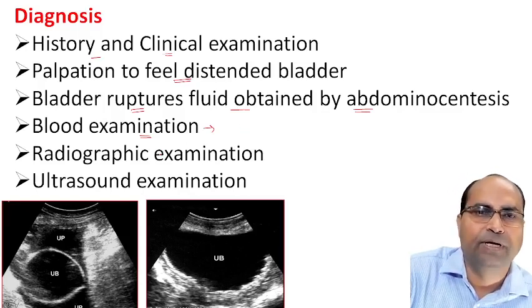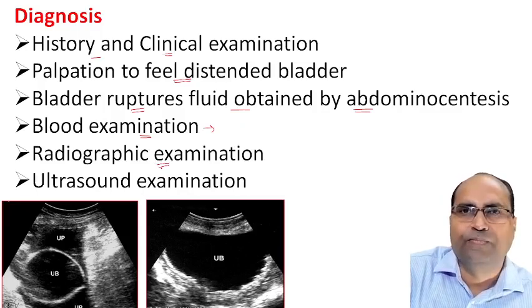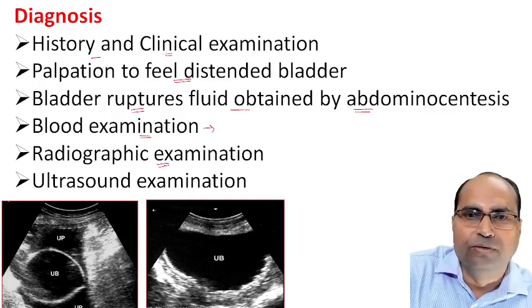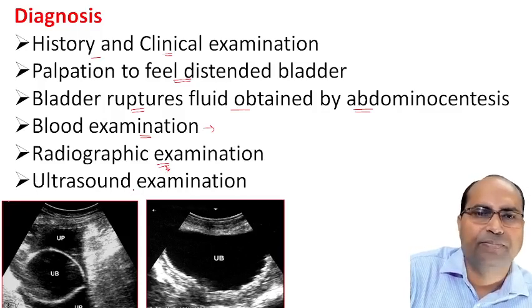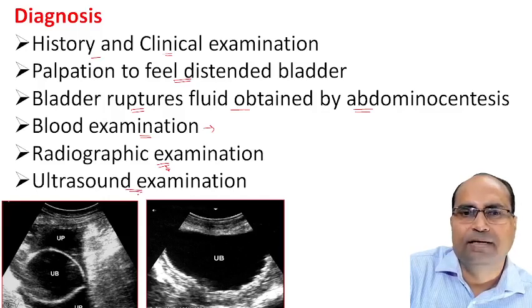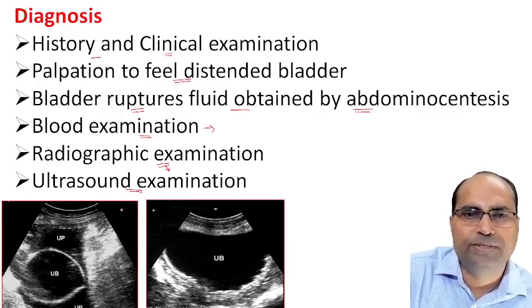Radiographic examination is helpful to find the calculi or site of the obstruction. Ultrasound examination is helpful to diagnose the obstructive urolithiasis.